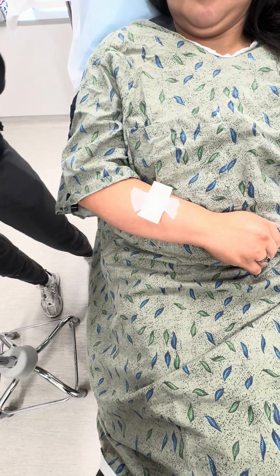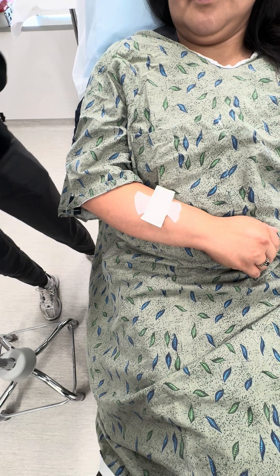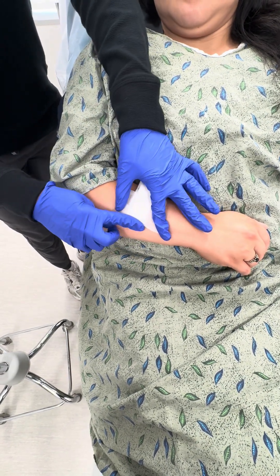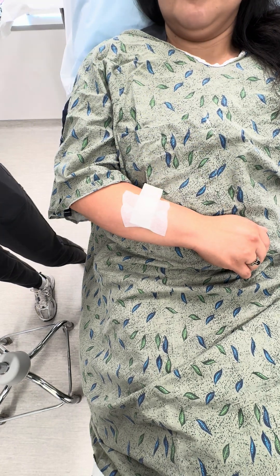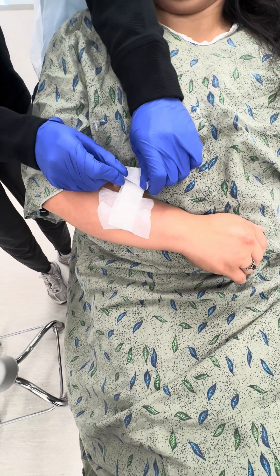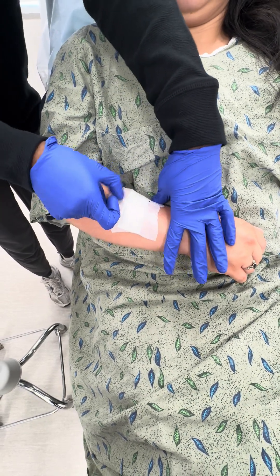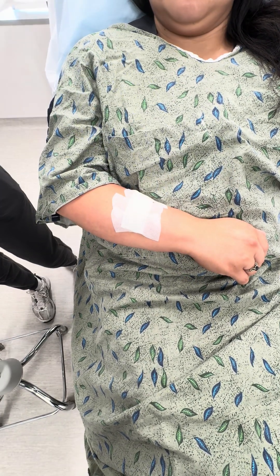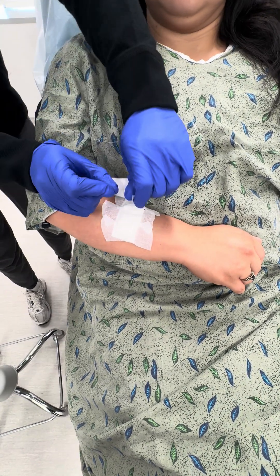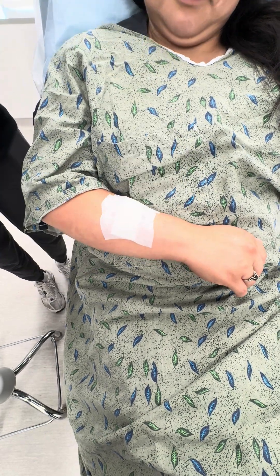You want to make sure every edge of the bandage is covered. And that is how you do a pressure dressing.